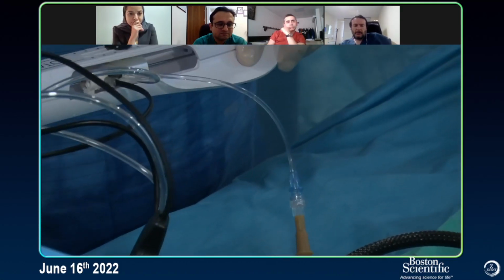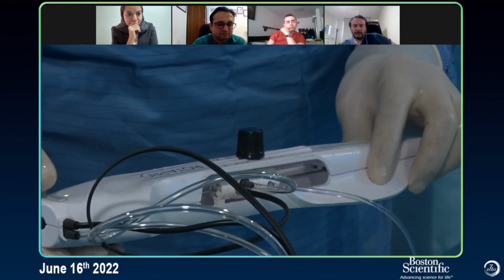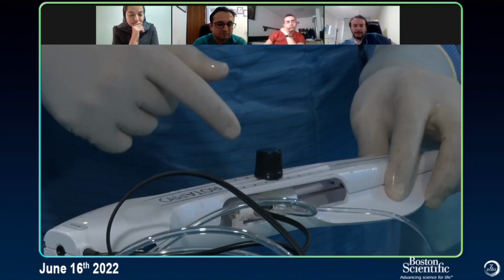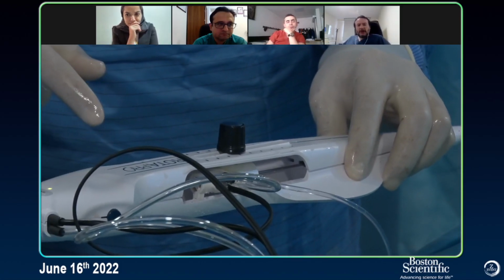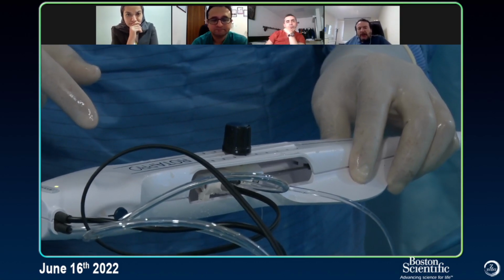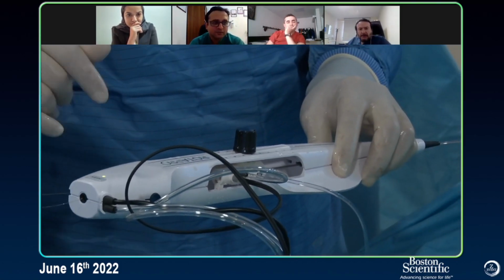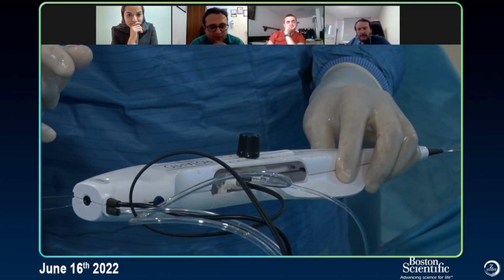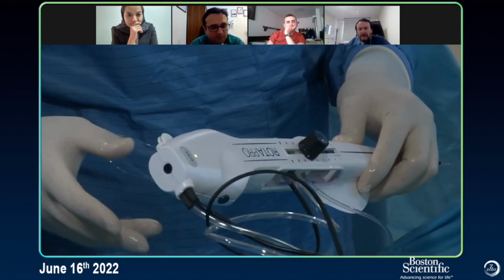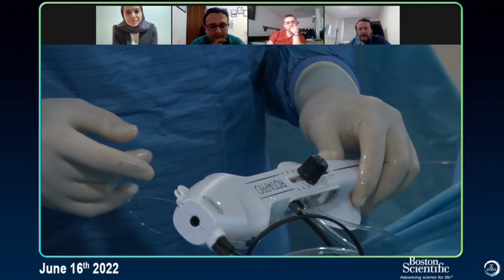We like to have Dynaglide mode. Okay, we activate the Dynaglide. You see the screen we have on the Dynaglide? Show them. Any comment about the Dynaglide? I don't use the Dynaglide for going in. What about you, Esad? I always press the first pedal on the Dynaglide before even starting burring. So I always go up and come out on Dynaglide, but I don't go in with activated Dynaglide.